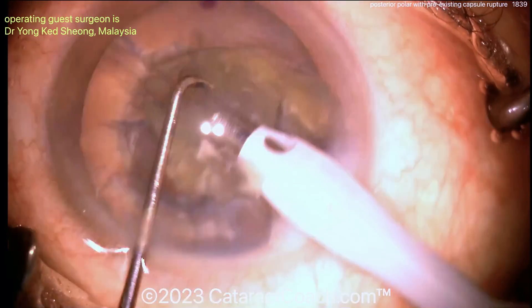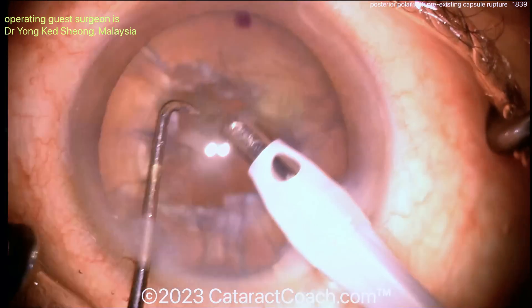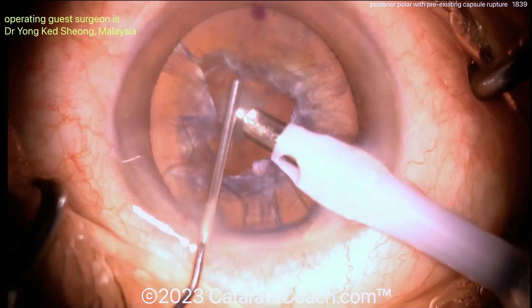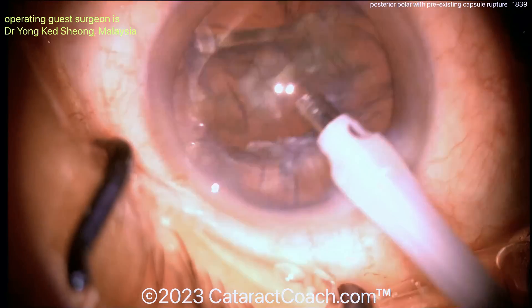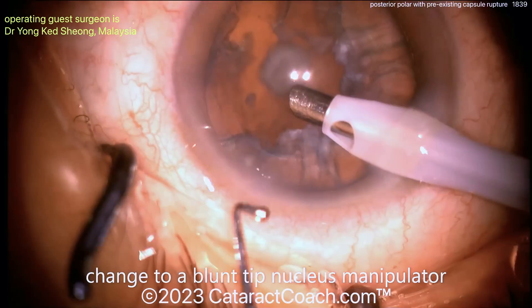Now we'll try to get out as much of that epinuclear shell as you can. You may need to do some visco-dissection. Again, there's that posterior polar opacity — don't let the AC collapse. Such a smart move here, very nicely done. Going in again, trying to emulsify that epinuclear shell, and it comes out pretty easily.